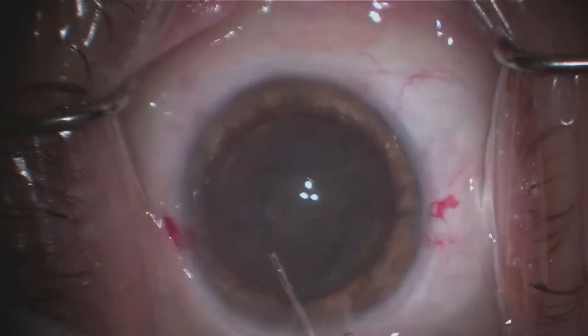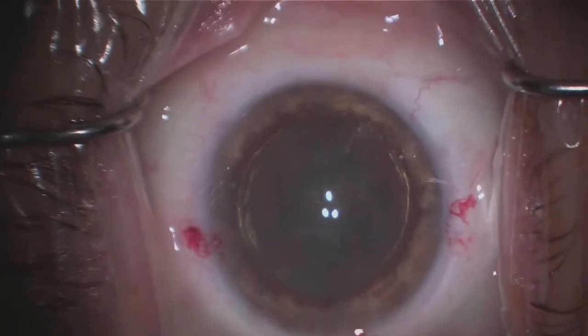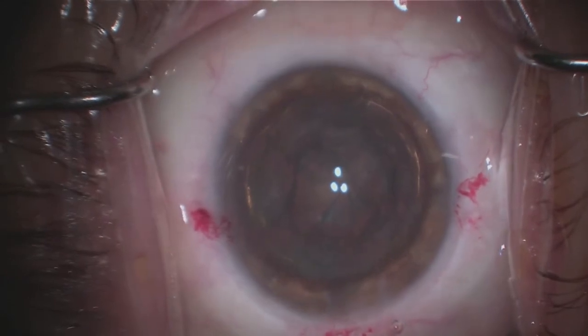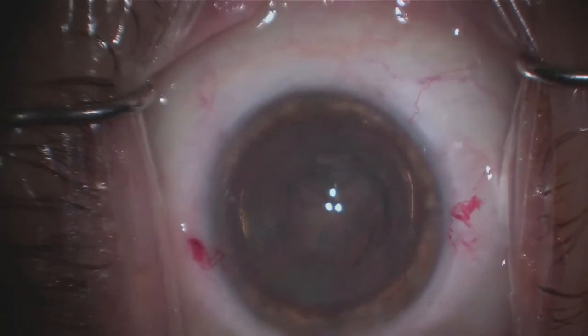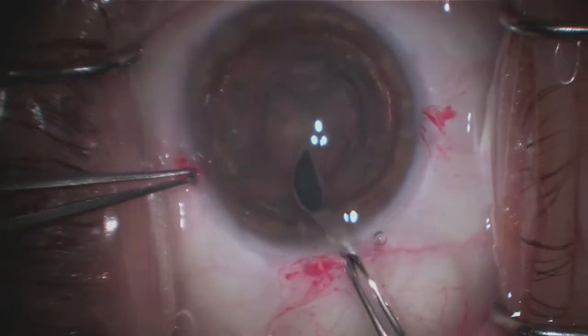In this next step, I'm injecting fluid to separate the lens from that bag — or the outer skin of a grape. Next, I'll go in with an instrument and actually create a separation of the cataract.